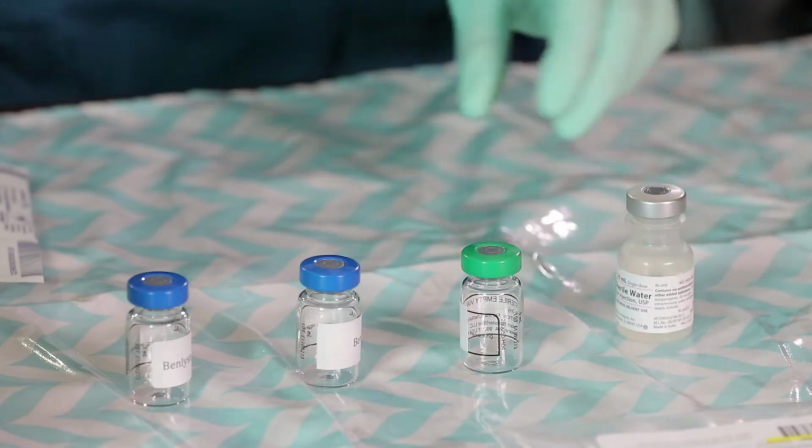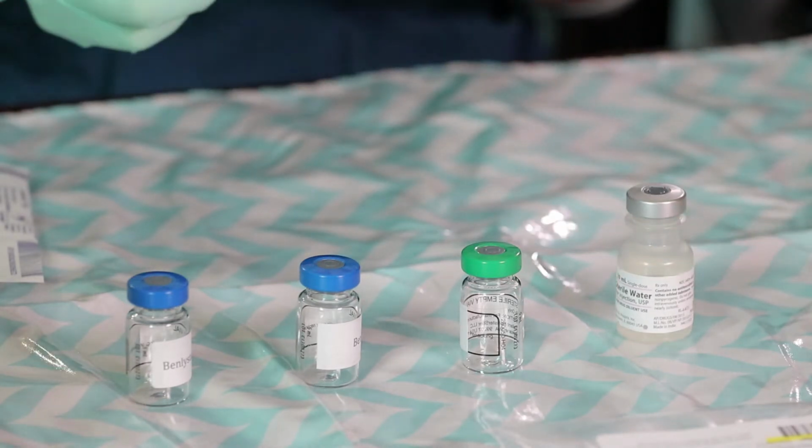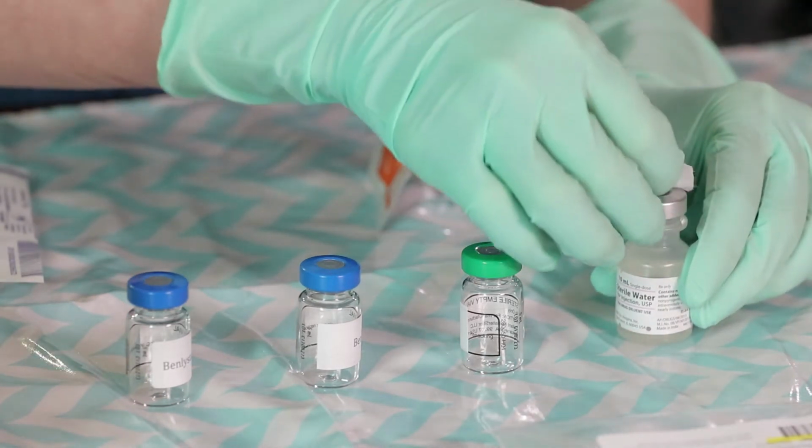Here we'll do an example of mixing a medication with multiple vials. First, we'll swab the vial tops in one direction for 15 seconds or at least 10 long, firm strokes. Be sure to use a fresh alcohol swab for each vial top. Since we need to reconstitute 3 vials of medications, we will use a dispensing pin in the diluent vial.